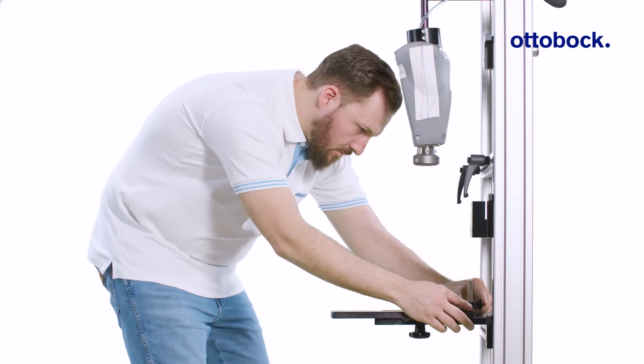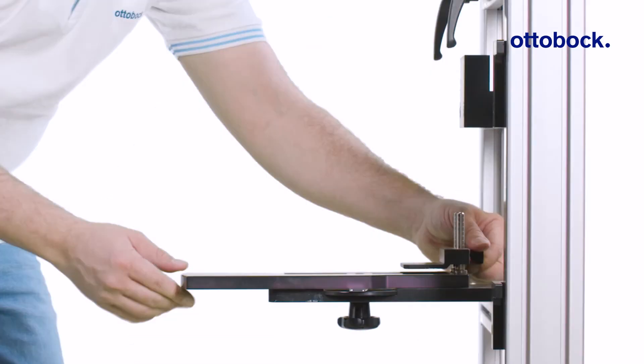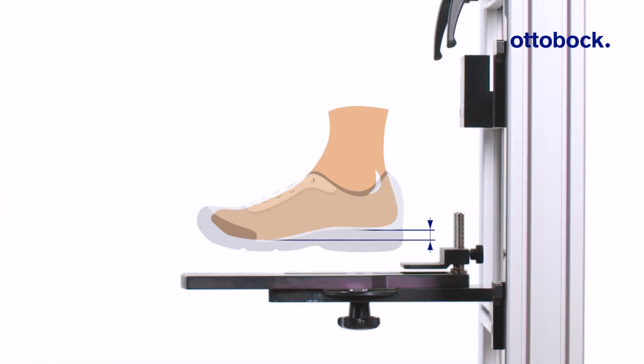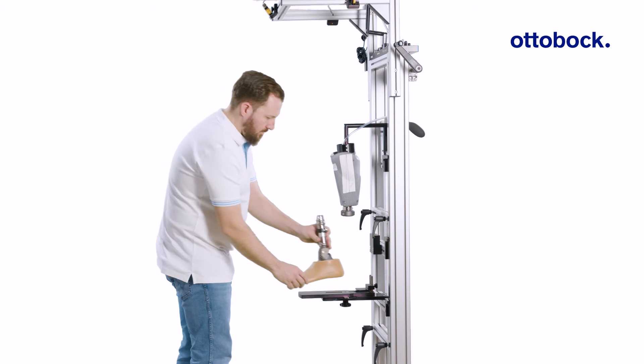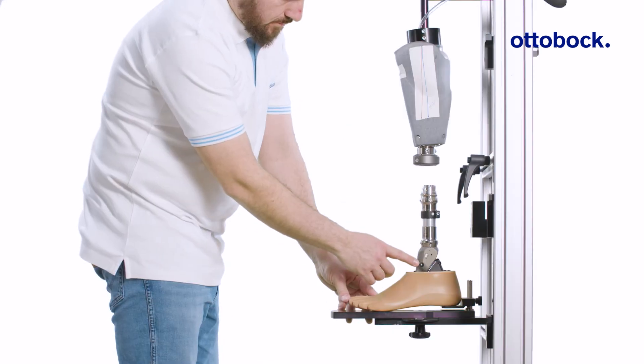With the Taleo ADAPT, the heel height plate must be set to the effective heel height of the user's everyday shoe. Don't add the additional height of 5 mm, which is often done with other Ottobock feet. Position the foot in the Proza assembly so that the alignment reference line runs through the alignment marking on the ankle and the socket reference point. Ignore any sagittal alignment marks on the foot shell.